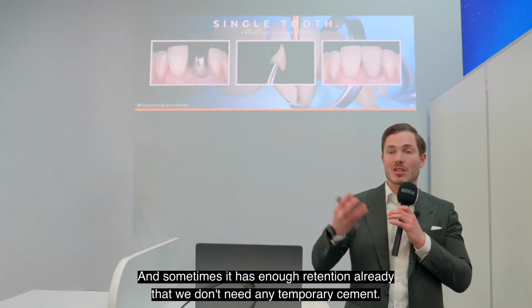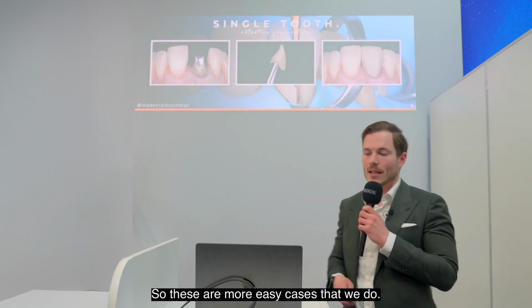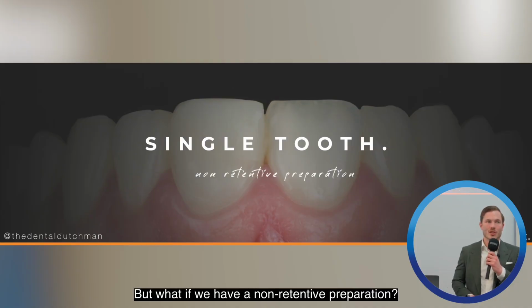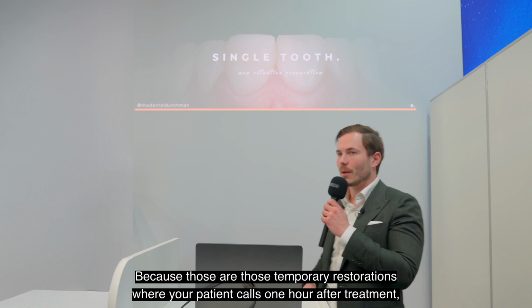And sometimes it has enough retention already that we don't need any temporary cement. So these are more of the easy cases that we do. But what if we have a non-retentive preparation? Because those are the difficult situations, because those are those temporary restorations where your patient calls 1 hour after treatment.